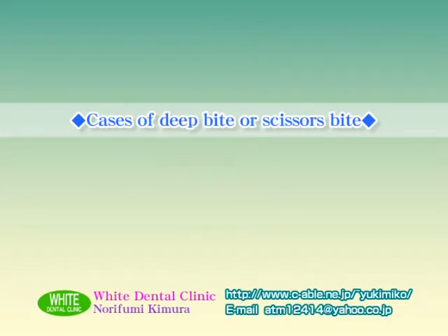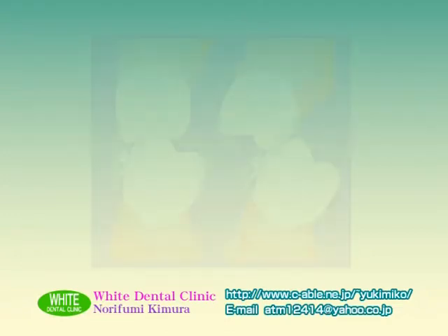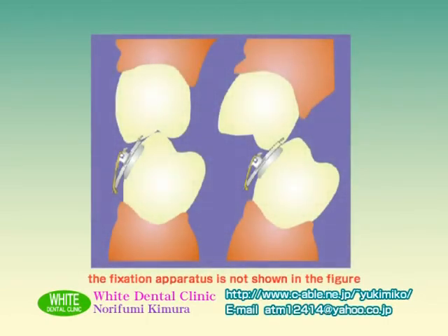Cases of deep bite or scissors bite. For patients with deep overbite or scissors bite, after the fixation apparatus is detached, during attachment of the bracket, sliding the bracket up to the position without interference to fix it with a ligature wire allows minimum interference with the opposite tooth and prevents the bracket from detaching. After improvement in occlusion, removal of the ligature wire and reset of the fixation apparatus allow orthodontic treatment as usual. The slide type bracket is applicable to most brackets available worldwide.